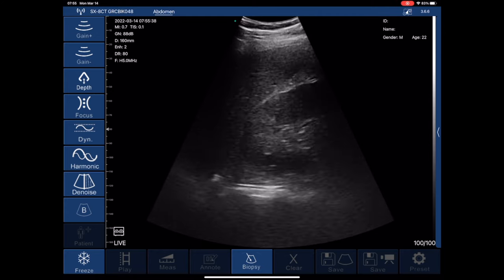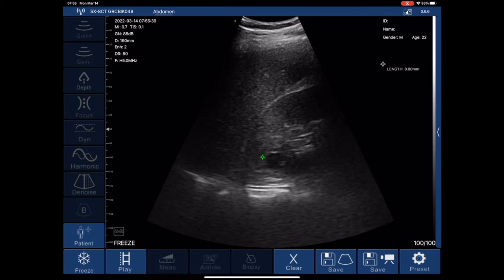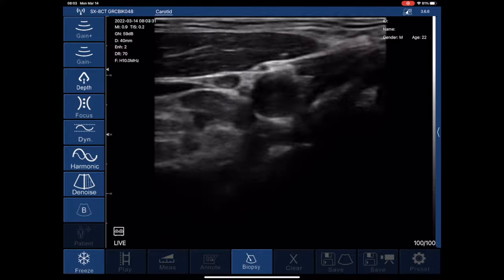The next scan shows a small cyst on the superior portion of the kidney. Again, I can use the measurement tools, dragging appropriately to get the measurement I want.